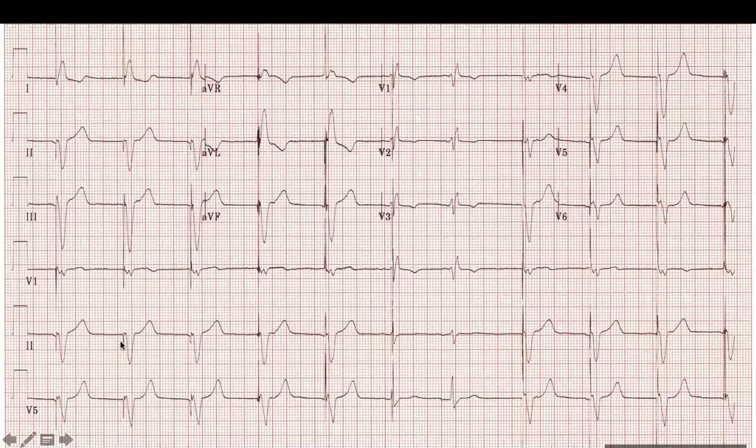There is a pacing spike here, and here, and here, and here, and here, but the next one has no spike. Let's stop here, because the QRS here are all the same, right? Yes. But this QRS is different. Yes, that is different.